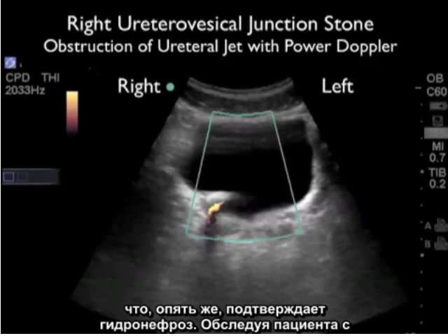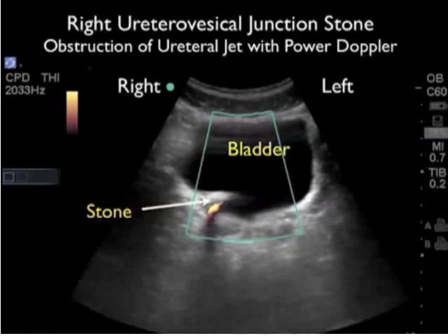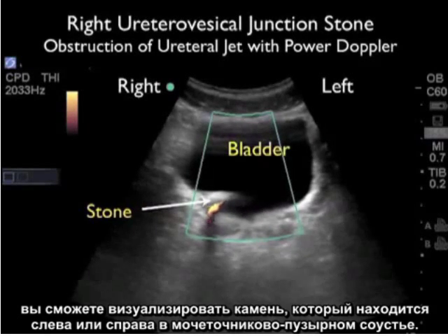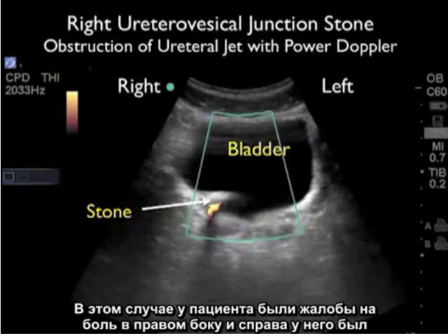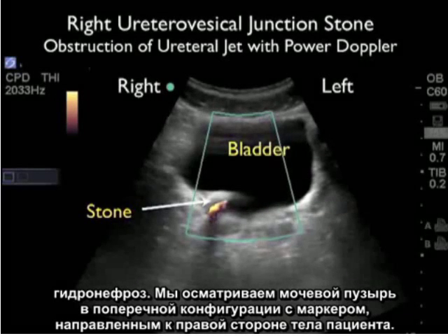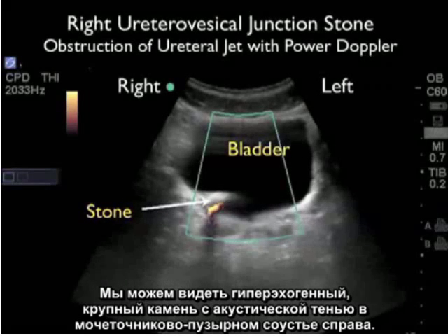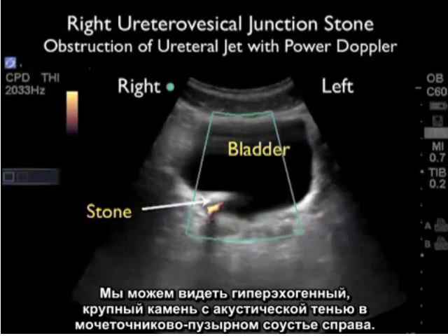When evaluating a patient with a possible kidney stone, when you find hydronephrosis, you should also look at the bladder, and you may be able to visualize a stone present at the left or right ureterovesicular junction. Here's a case in which a patient presented with right flank pain and had right hydronephrosis. We're looking at the bladder in a short axis configuration with a marker dot over towards the patient's right side. What we can see is a hyperechoic, large shadowing stone present at the right UVJ.